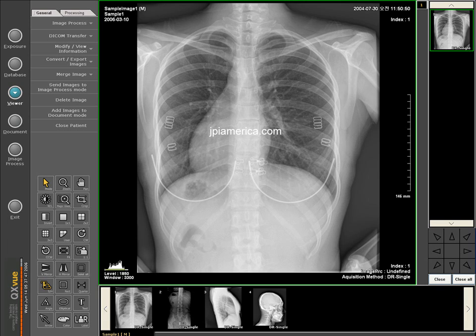Outside of the United States and North America, when the films are placed or oriented on the screen, or when the image is oriented on the film or on a monitor, it is not placed relative to anatomical position as it is in the United States and North America.